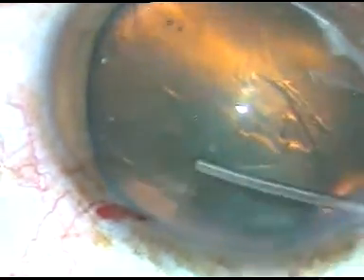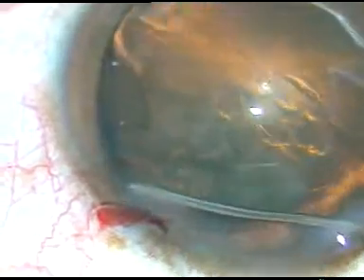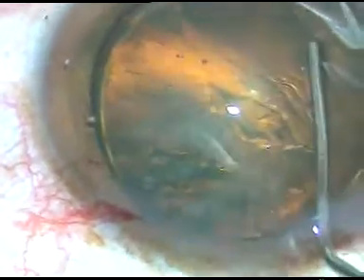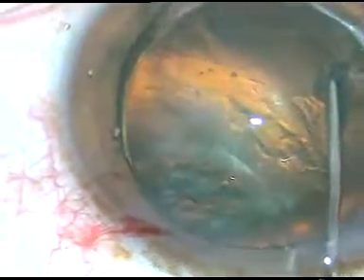Hydrodissection is done with BSS. The patient is moving his eye and I am struggling to keep focus on the operating field. Hydrodissection and hydro-delineation are both done. Hydrodissection has caused a golden ring in this case.